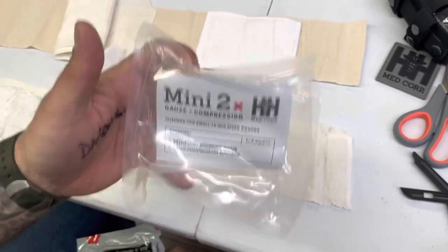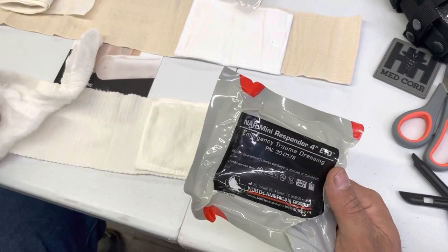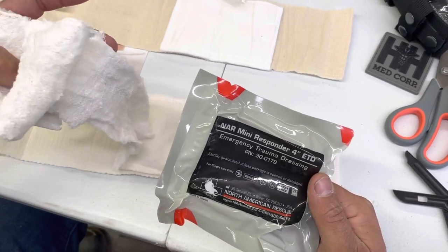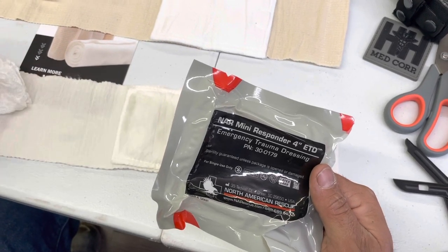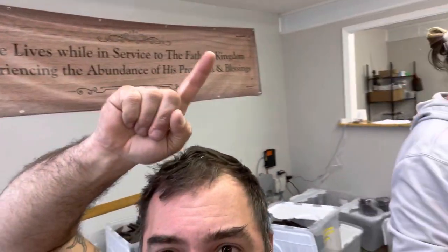Same size pad, same elastic, same everything. For $10 the H&H is definitely a good product and that gauze is excellent. For $4 plus $2 in compressed gauze, totaling $6, the NAR is also well served for small to medium sized wounds. Tell me in the comments what you think - H&H for $10 or NAR with compressed gauze for $6? I think you're well served with either, but I like the North American Rescue. We're vendors for both of them.